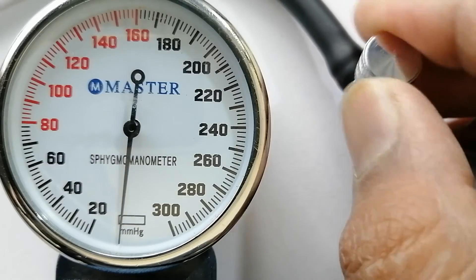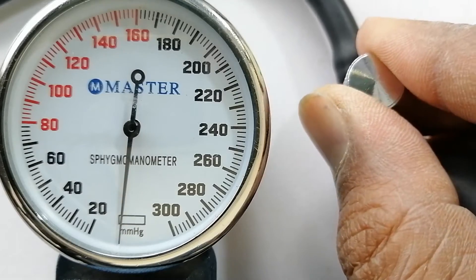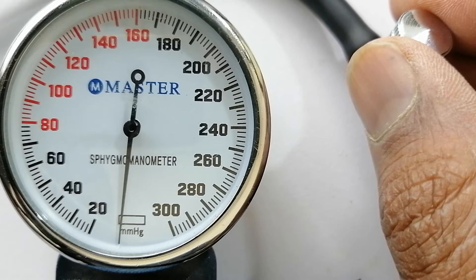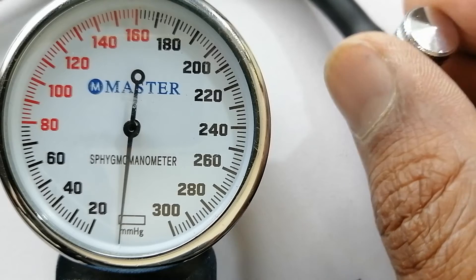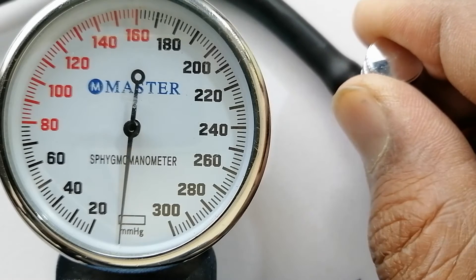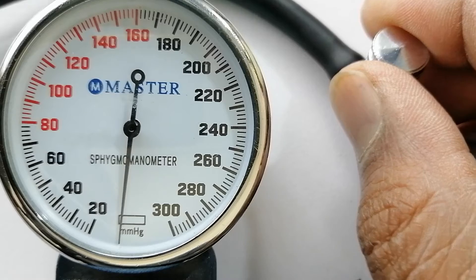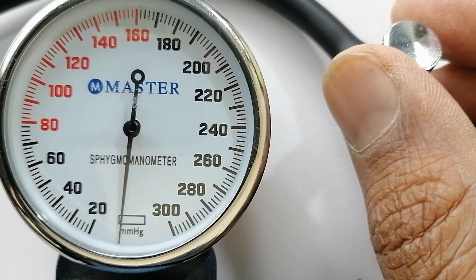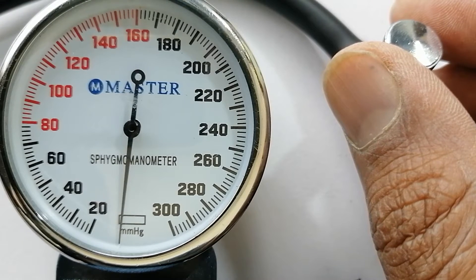Now I close this valve completely so that no air escapes. Now I will inflate up to 180. After that I will open the valve a little. As soon as I open it, air will start coming out and the needle will start coming back. Then there will be a point where you can hear the sound of the pulse — this will be the systolic blood pressure.